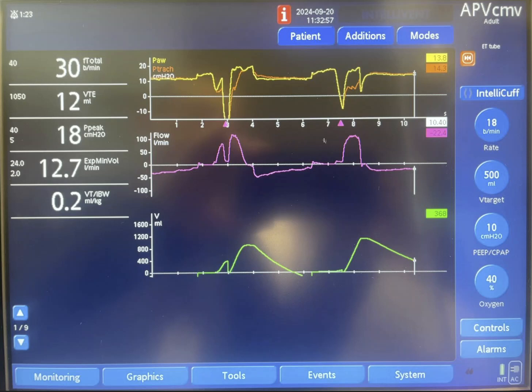But again, this pressure did not result in any flow or tidal volume. Then the patient initiated a breath — you can see a huge, high flow and large tidal volume. The same asynchrony pattern happened again.